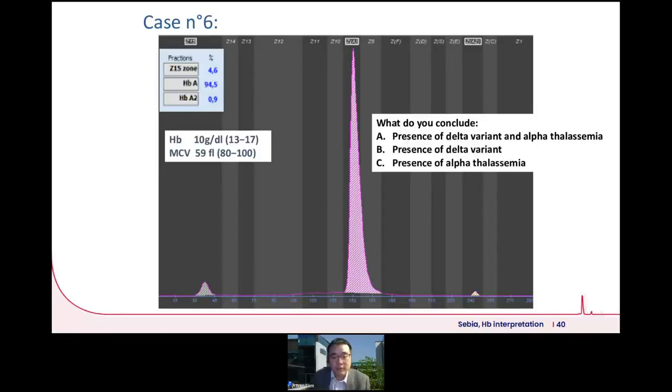So what about this case? Okay, so there is the presence of hemoglobin H. So this very distinctively is a presence of alpha thalassemia. And because alpha genes are being reduced, you do not see that increased hemoglobin A2 as well.